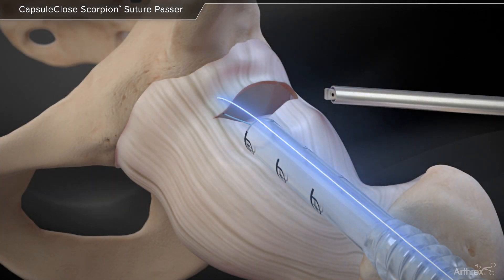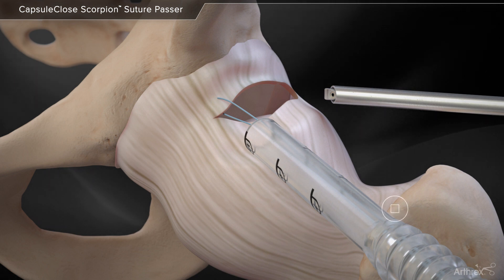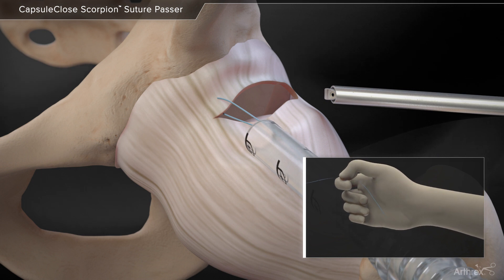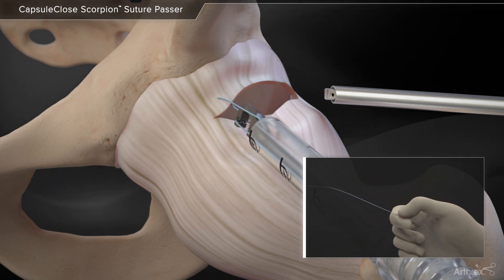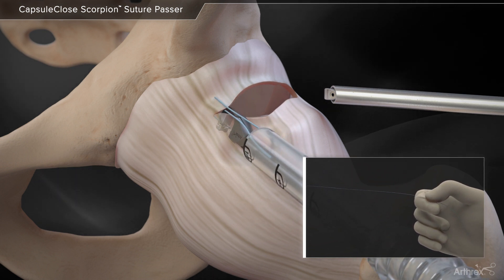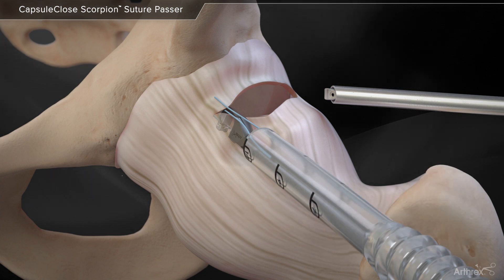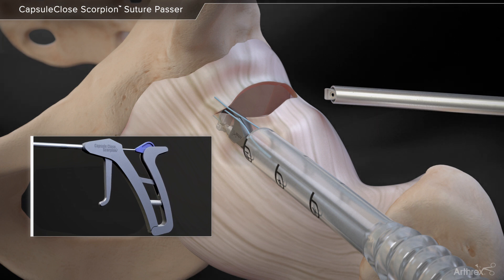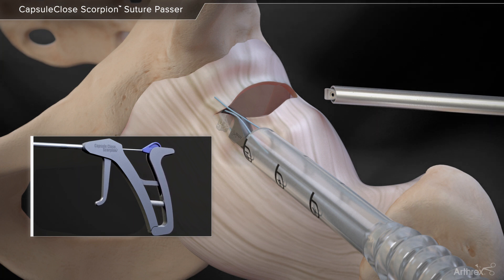As the capsule-closed scorpion is introduced back into the Trimit cannula, pull the slack out of the previously passed fiber wire. This will prevent looping of the suture as the scorpion advances through the cannula. Repeat previous steps by first squeezing the front trigger, followed by the rear handle, to pass the fiber wire suture through the capsule.